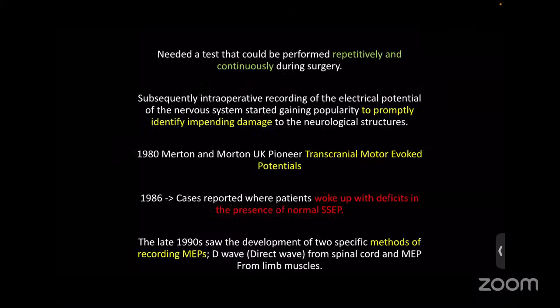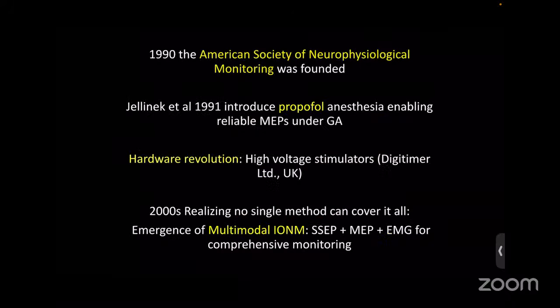That is when people started exploring the intraoperative recording of electrical potential produced by the nervous system, trying to look at the neurology indirectly, right? So we developed the SSEPs and the MEPs, that is the somatosensory evoked potentials and the motor evoked potentials. Even then, there were cases where patients with normal SSEP would wake up with neurodeficits. And so we understood that a single method cannot cover it all. And so now we have the multimodal IONM.